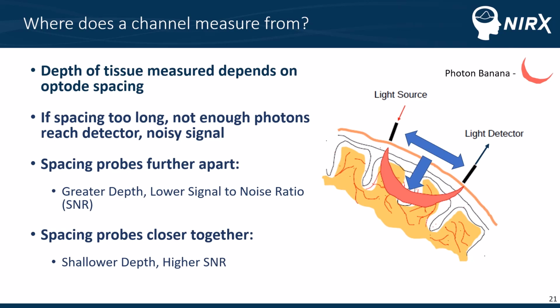So the exact depth of your channel spacing is going to depend on what you're interested in as well as your hardware. Not all fNIRS hardware is created equally, and not all can get high signal to noise levels in channels that are farther apart.